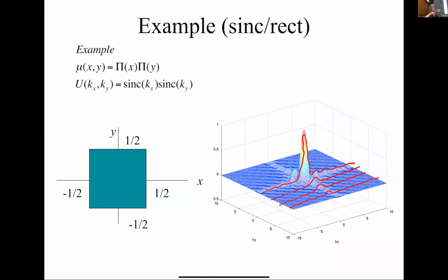As a function of time, going this way is actually pretty fast. We can just zoom across it. Remember, this is called the frequency encode, or also readout direction. And for spin warp, this direction here is called phase encode, where we step line by line, and that tends to be the slower direction.